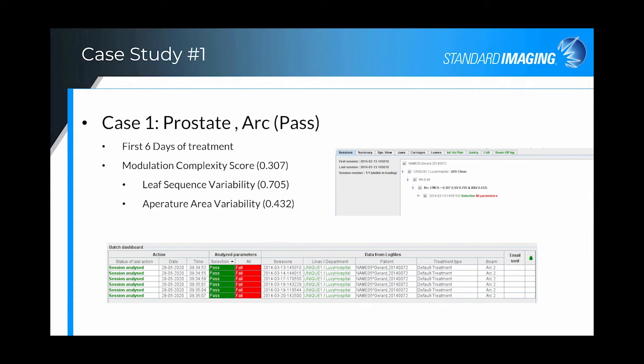So you could watch your modulation complexity scores, just look at that after you have exported into LinacView. And then if a particular plan has a particularly low modulation complexity score, then you can do the pre-treatment analysis and get out your other measurement device if you would like to go ahead and check on some of these plans with an independent measurement device as well, for plans that have a particularly complex delivery. But this one had a pretty straightforward and easy delivery.